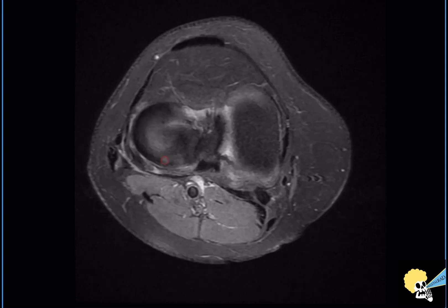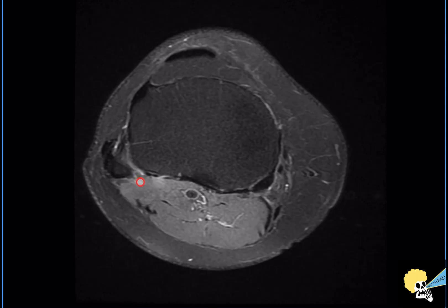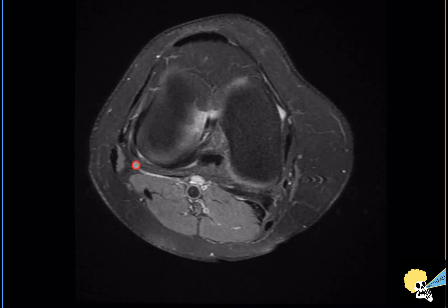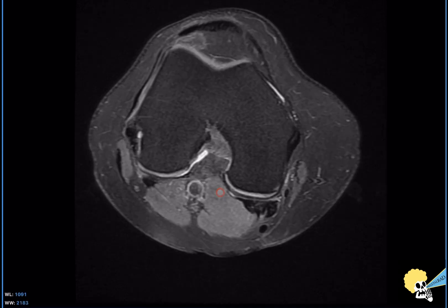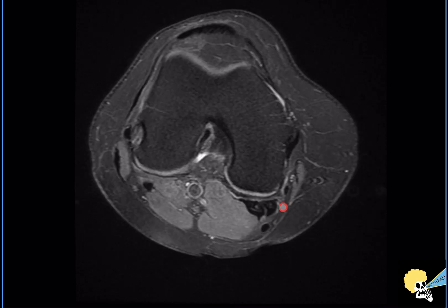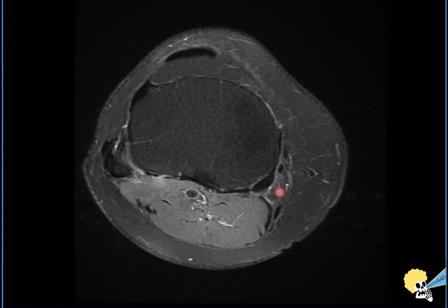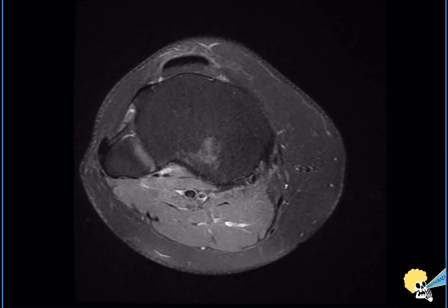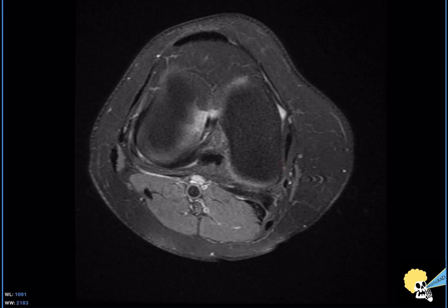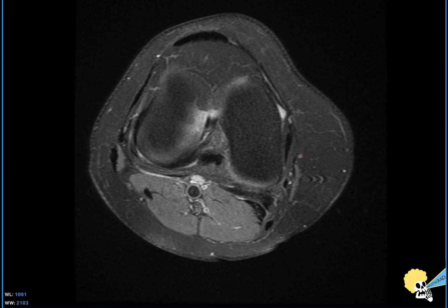Also on the axial image, I like to evaluate the posterolateral corner — making sure there is no abnormality in signal intensity, cysts, or any edema that may suggest injury. I also look at the posteromedial corner, in particular the semimembranosus and medial head of the gastrocnemius. Where they cross is where a Baker's cyst would be, but I make sure the tendons are all right. Then I look at the pes anserinus tendons — the sartorius, the gracilis, and the semitendinosus — making sure there is no fluid underneath their insertion to rule out bursitis.